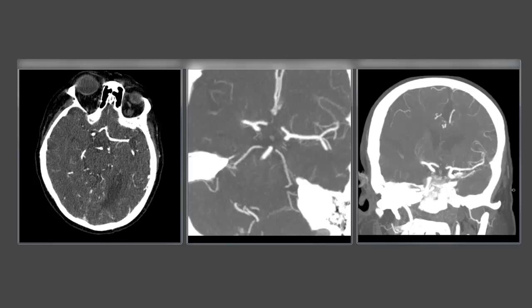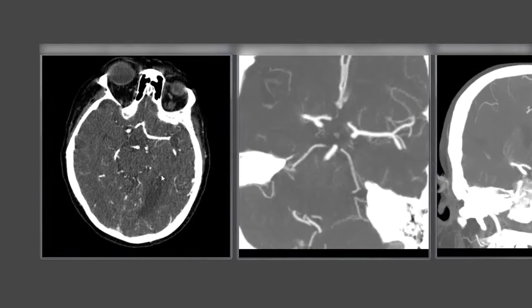In this video we're going to look at some other examples of MCA large artery occlusions. We have our source images and then our axial thick MIPs, which are slightly off the axial plane in this particular example, and then a nice coronal thick MIPs reconstruction.